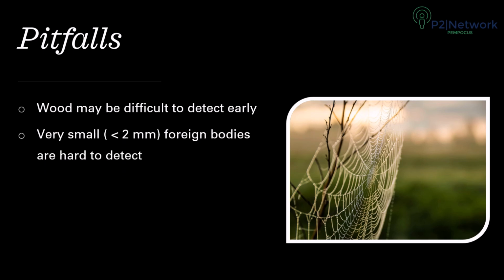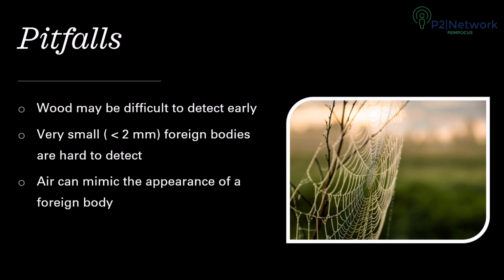There are mimics with foreign bodies. Air can be a mimic and can even have some reverberation. Care must be taken to scan through the entire tissue area systematically and in two orthogonal planes to not miss the presence of a foreign body.